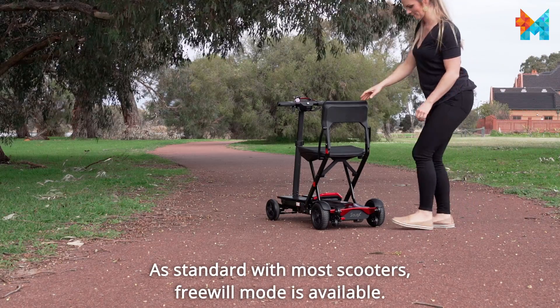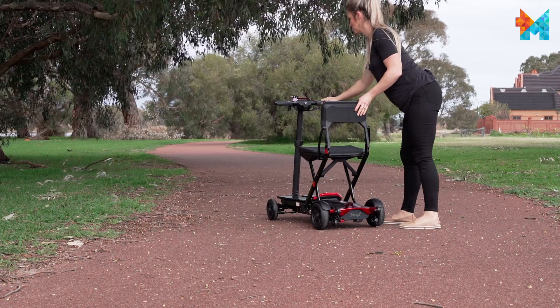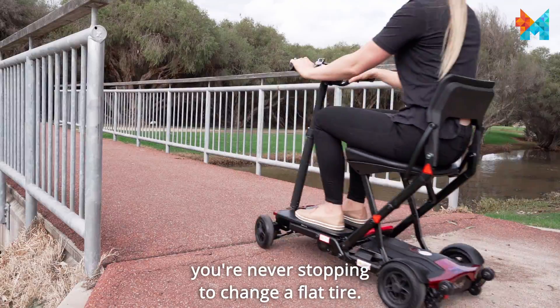As standard with most scooters, freewheel mode is available. Solid puncture-proof tires ensure you're never stopping to change a flat tire.